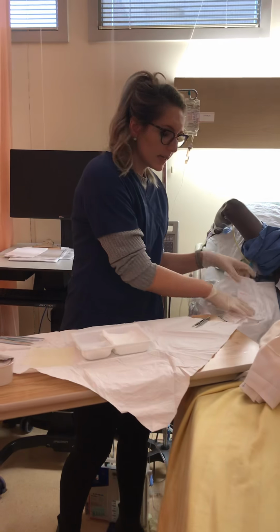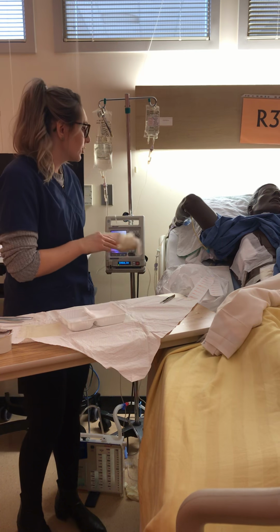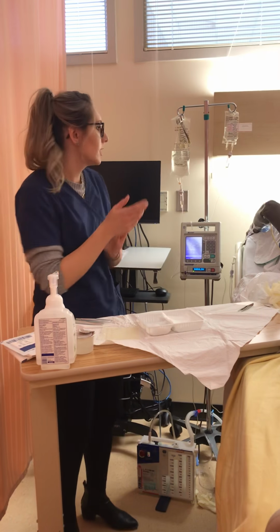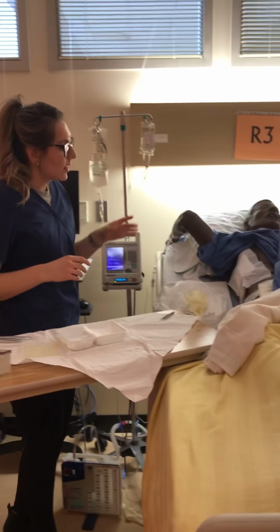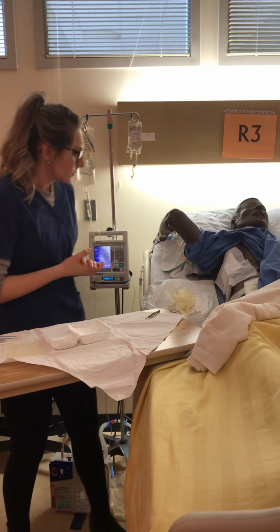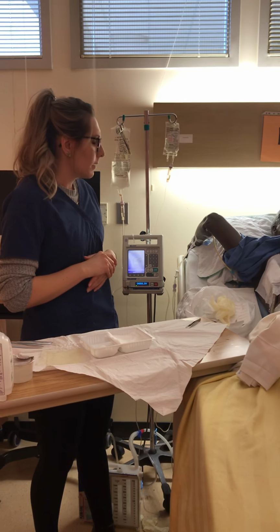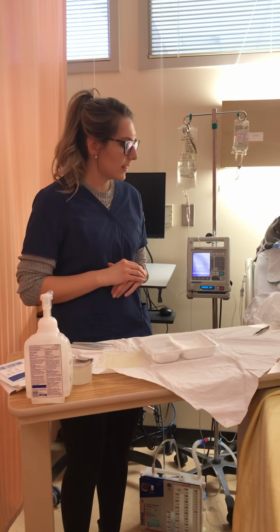Okay, so then I'll just clean everything up. I'll lower the bed to a comfortable position, make sure my patient's arm is back in a comfortable position. I'll perform my hand hygiene. I'll document with the nurse on the continuous infusion that we did, as well as noting the stoma site here, as I just need one for the drainage findings, and I'm going to make sure that everything's running well, and I think that's it.